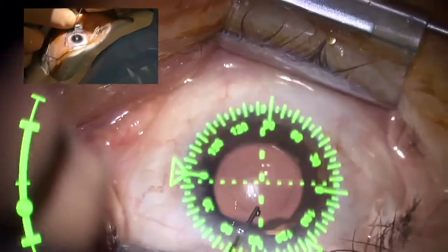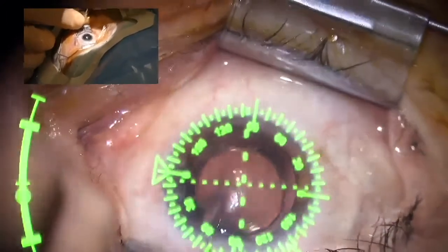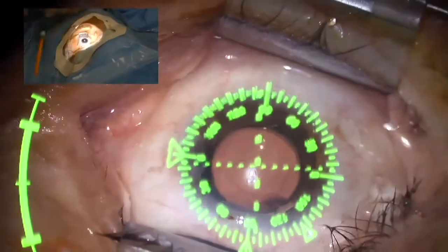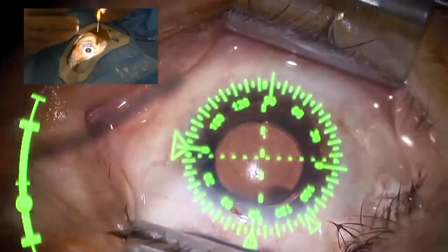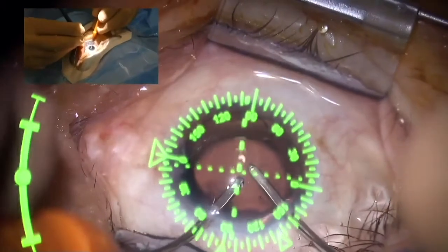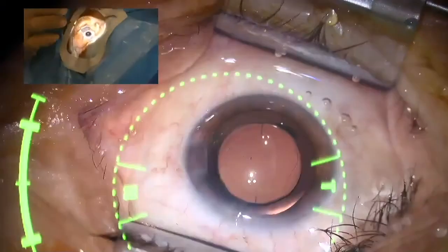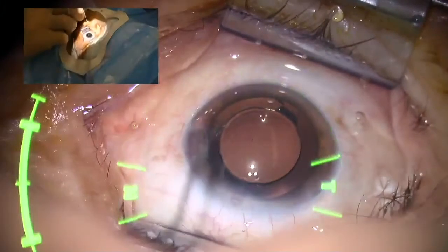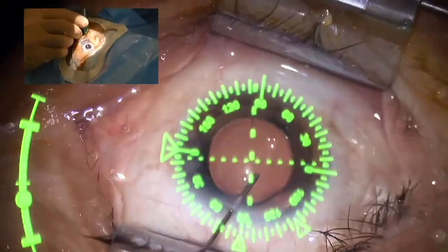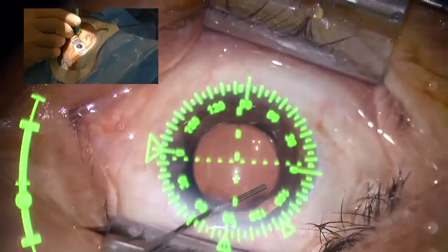After the implantation, normally when I only implant one toric IOL in the capsular bag, I would now remove the whole viscoelastic. Now I will do the same, just to have the bag clean with Helon. And now I fill the A.C. up again with Provisc and try to create more space between the iris back face and the capsular bag.